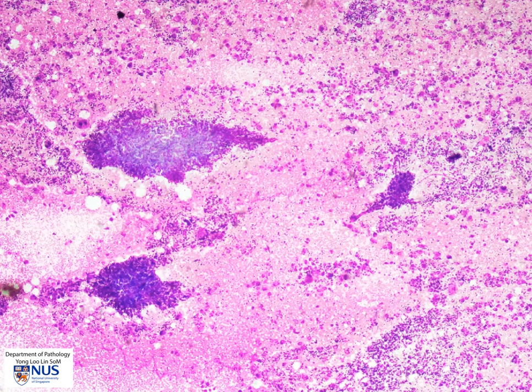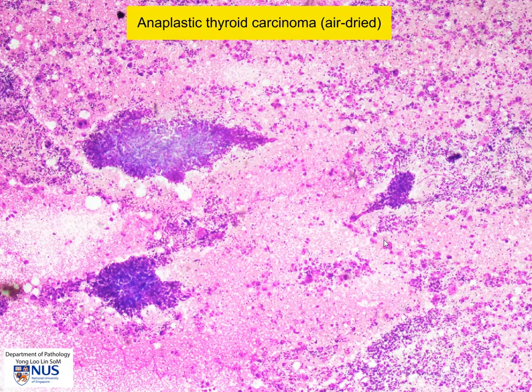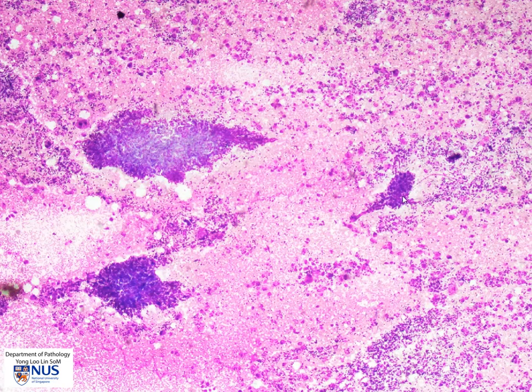This is an aspirate taken from a case of anaplastic thyroid carcinoma and we're looking at the low magnification view of the air dried smear. We can see at low magnification that there are some large, quite crowded appearing tissue fragments and at the same time there are extremely large, quite dispersed cells.